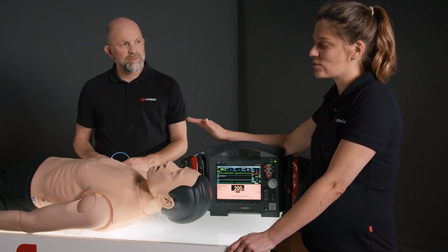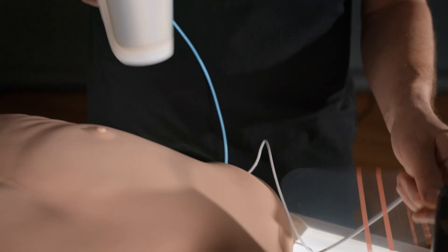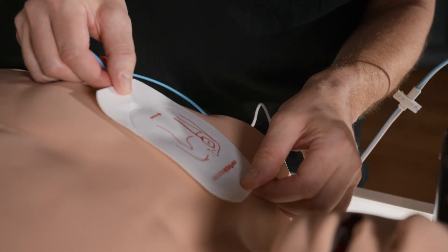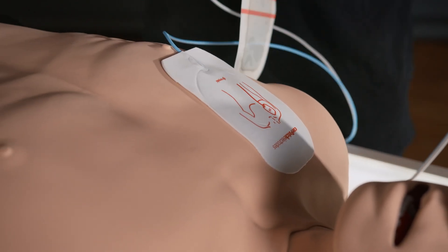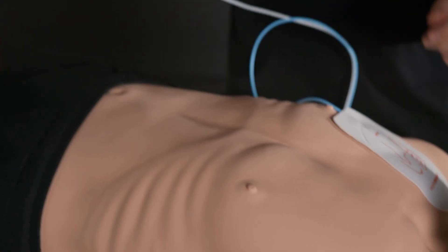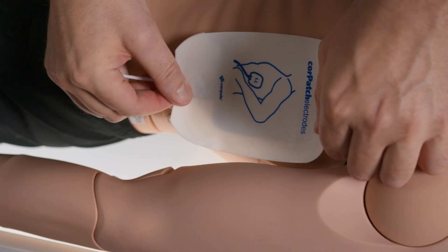We then need to make sure that we position the electrodes correctly. For the antero-lateral positioning, we take the right red electrode and position it on the front of the chest on the right side just below the collarbone. The blue electrode is positioned laterally on the left side of the thorax, as laterally as possible below the armpit.